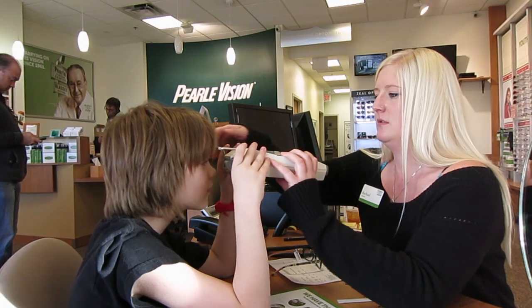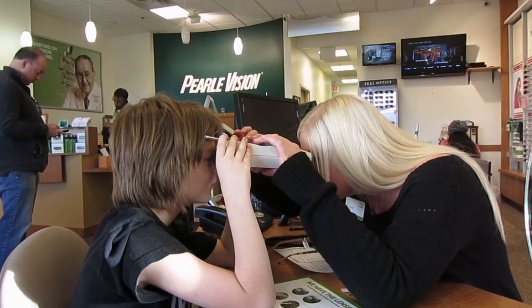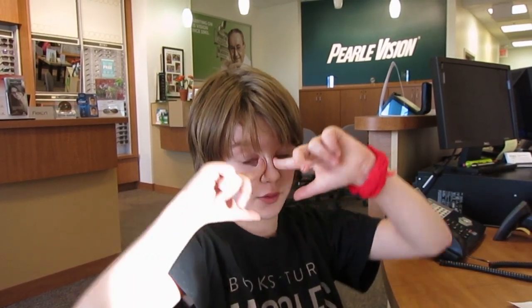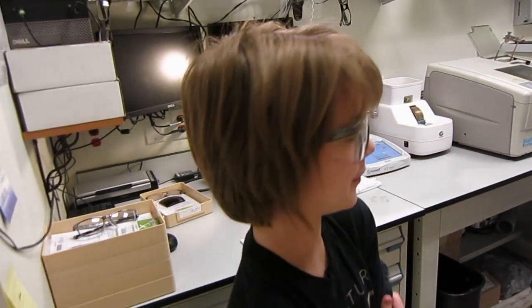Hold that up like a pair of binoculars — see that green target? Focus on the very center of it. So actually I'm going to get to watch them cut the lenses. They have the lenses I'll need for the glasses, so I can watch them cut the lenses. They measure how far apart my pupils are and where my pupils are — because they want the center of the glasses lens to line up right with the center of my pupil. That's called the optical center — that is the technical term. Right now I'm getting the lenses carved to go in the glasses; they don't come with glass lenses, and it's a really cool-looking process.